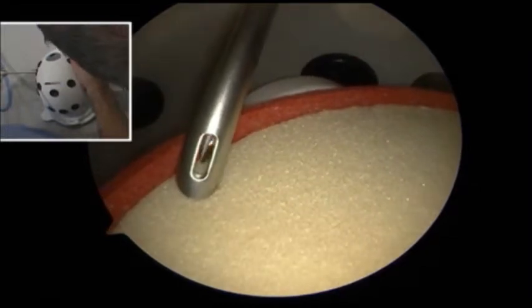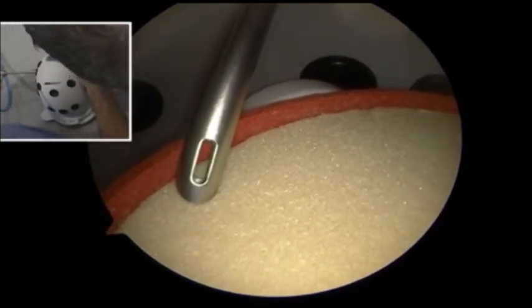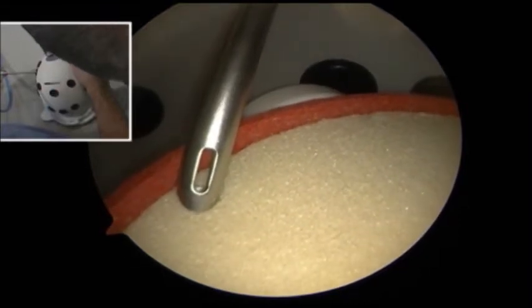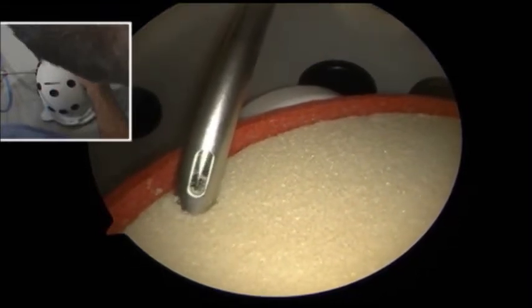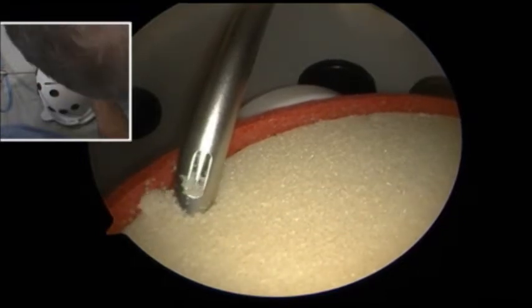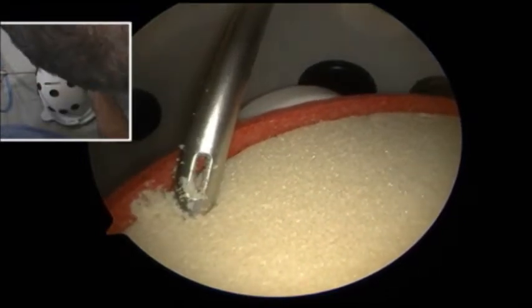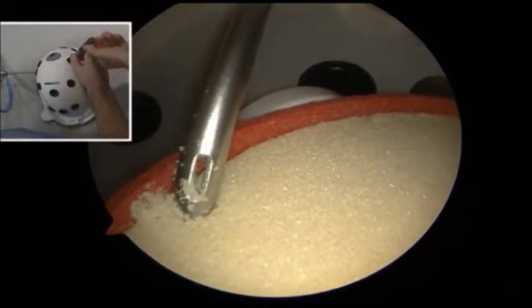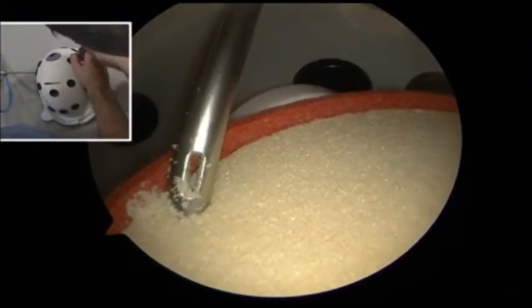And I always tell folks when putting in these anchors that you want to do this with the drill on at all times to decrease the amount of friction in the drill guide, especially when pulling out. This has a hard stop on it. He's got the drill on as he comes all the way out, again, so that the friction doesn't take me off of the glenoid face.